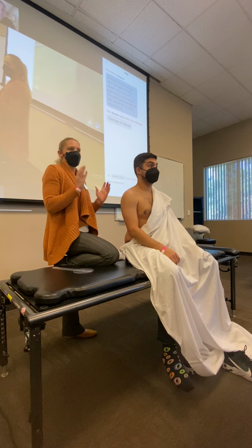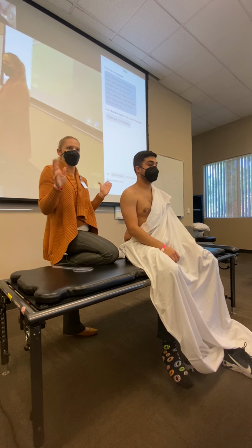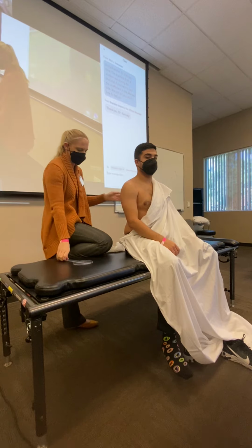I do want to show you goni for elbow flexion extension before we break, because those are easy, and then we can move on. So I'm going to have you lie on your back for me, please.